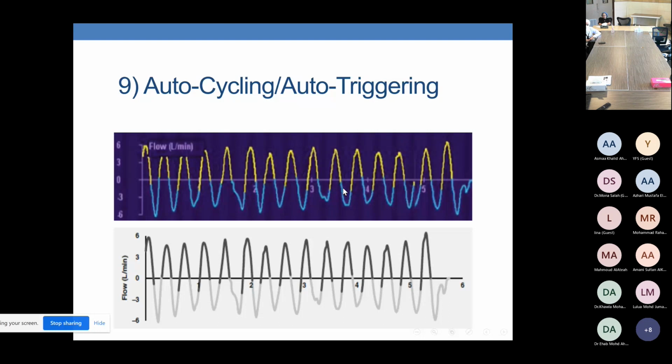Frankly speaking, we were having a lot of issues when we got the new ventilators, and alhamdulillah, finally we could sort it out by understanding that the temperature sensor for the tubings, for the humidity, should be outside the incubator. If it is outside the incubator, it will properly warm the ET tube, so you don't have condensation. Why? If the condensation happens, what would it cause?